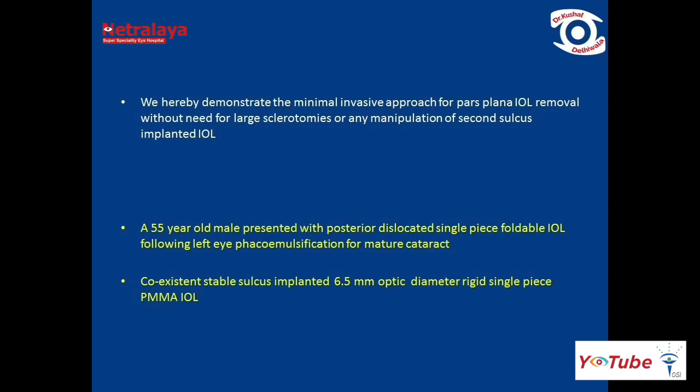A 55-year-old male presented with a posteriorly dislocated single-piece foldable IOL following left eye phaco surgery, along with a stable sulcus-implanted large optic diameter single-piece PMMA IOL.